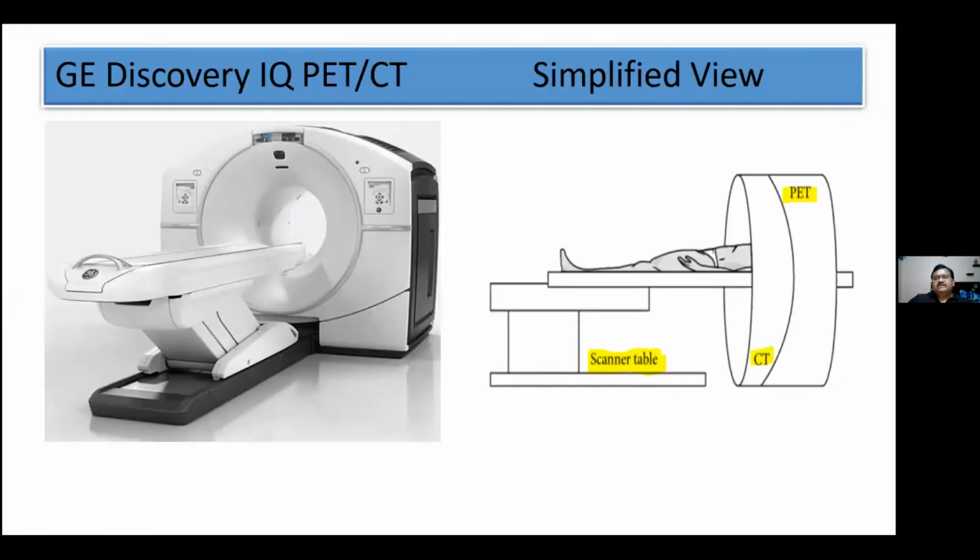Now, this is just a demonstration of PET CT. We all know this is the PET CT which I am using. This is a GE Discovery IQ PET CT. I have a very simplified view for people or residents who want to understand how a PET CT machine is.